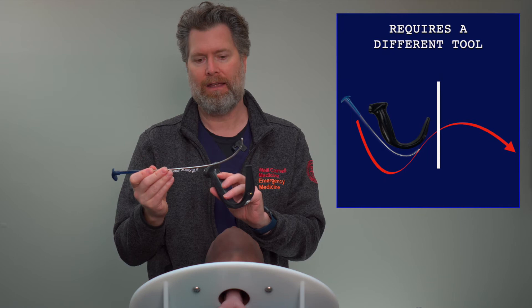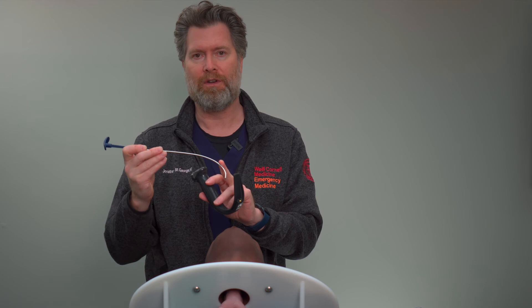What this requires is a different piece of equipment — the rigid stylet — and it requires an extra set of skills that you'll need to learn: to soften the tube, retract the stylet, and then drop the tube 90 degrees so that you can get it off the anterior tracheal wall and deliver it to the trachea.